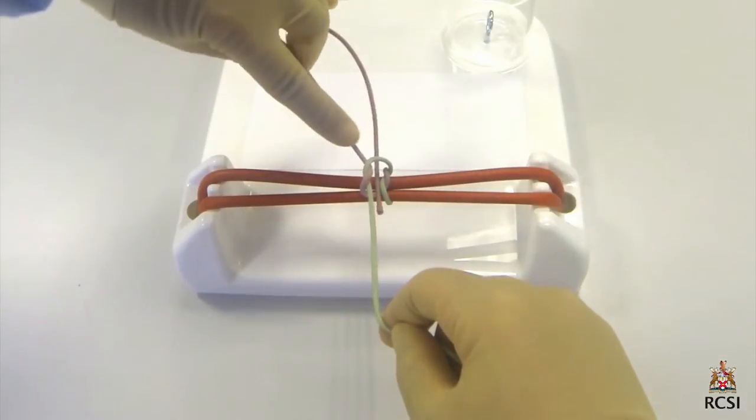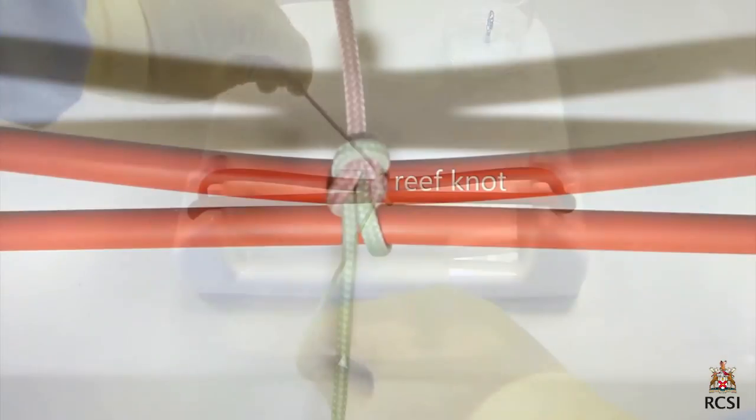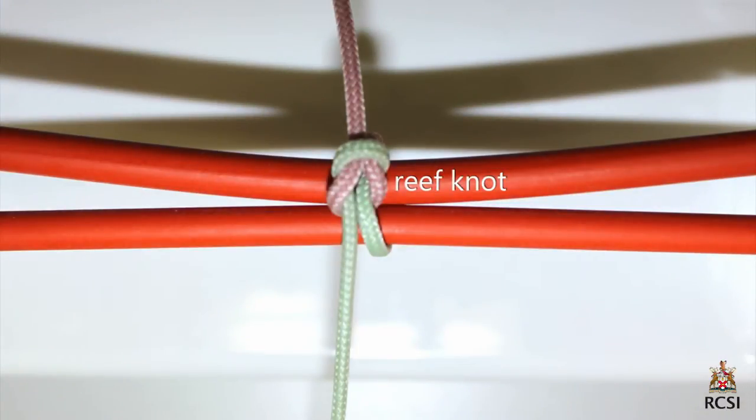The pink rope is pulled away from the surgeon to where it started, and the green rope is pulled towards the surgeon. A reef knot has been completed.